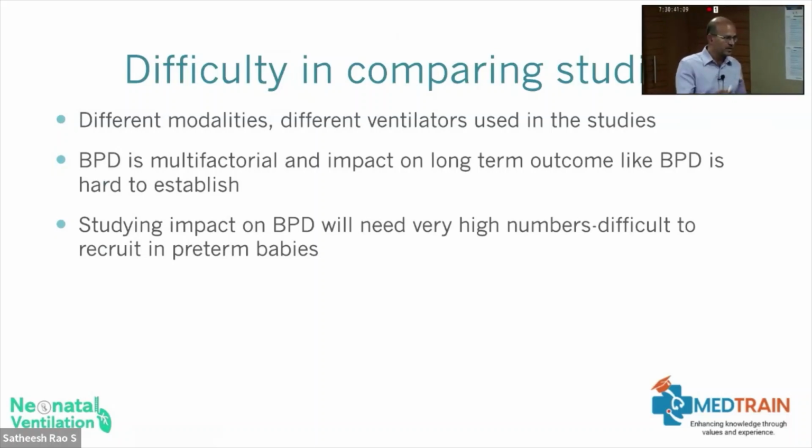What I do may not be the same as Dr. Karthik does, but both are correct. As long as your understanding is okay and you're titrating to the disease physiology, there is no absolute right or wrong. So you have to be flexible with it. If someone doesn't like SIMV in your unit, we don't need to fight that, I will use SIMV. So we can always adjust for that.